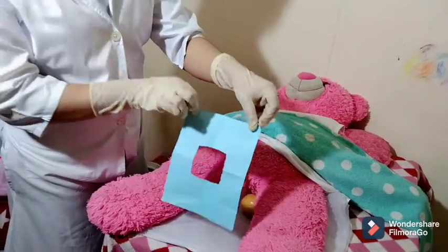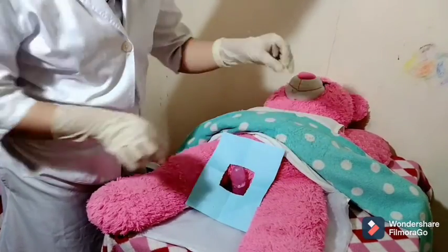Grasp the upper corners of the fenestrated or eye drape and unfold it. Place the fenestrated drape aseptically over the perineal area with the penis extending through the opening. A drape provides a sterile field where the equipment and hands will be placed. It prevents accidental contamination from adjacent areas.